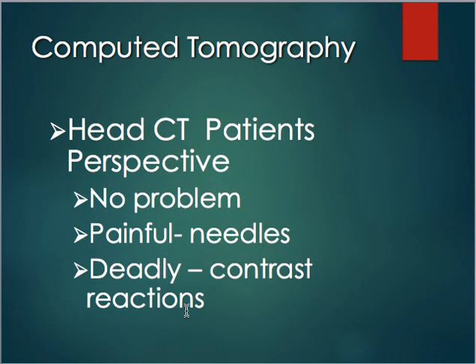The patient perspective for a head CT is it's pretty easy, especially if it's non-contrast. We do non-contrast head CTs and with contrast. It's going to depend on what the doctor's looking for. So if they don't have to have contrast, then it's really easy. They're so quick. You don't have to do much. You can take off your glasses, maybe your necklace, earrings, things like that.